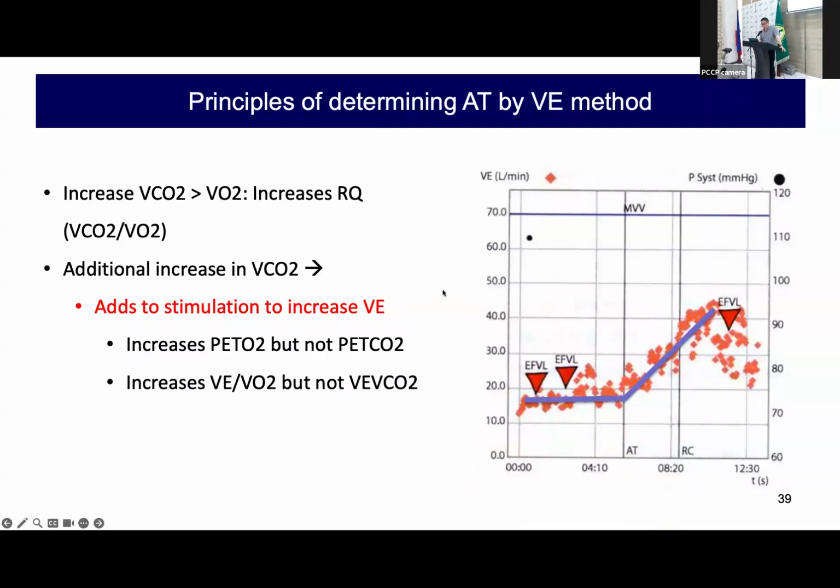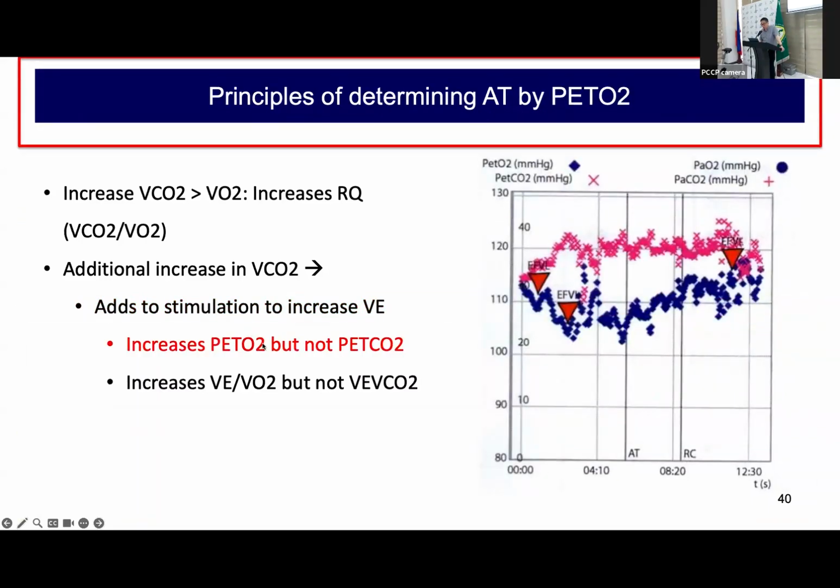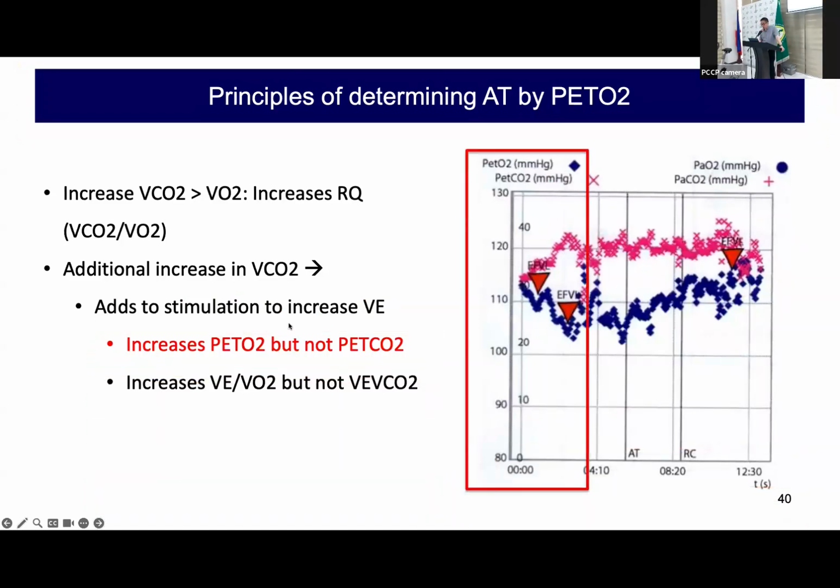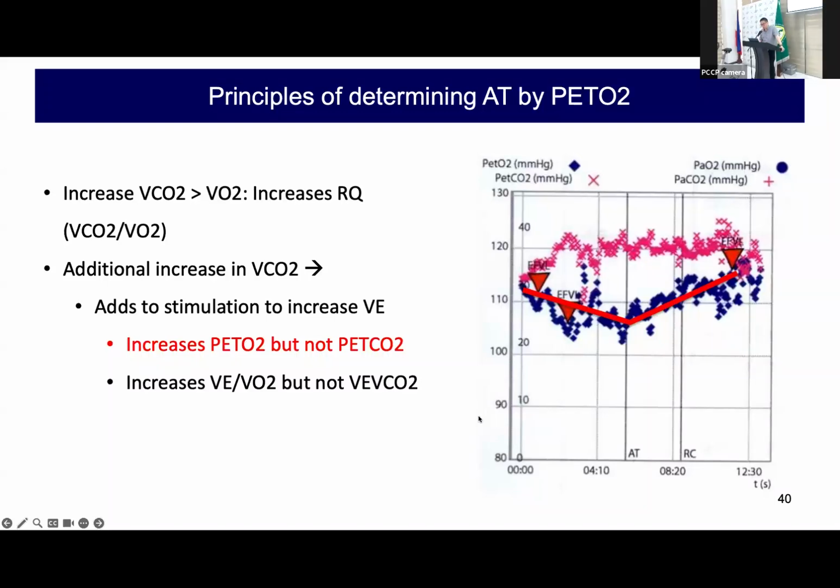Third, okay, the PETO2 method. Okay, there will be an increase in PET. X is time, Y is end-tidal O2. Can you recognize? It's in blue. Okay, notice, bumaba muna, tapos tumaas dito. So that's the onset of anaerobic threshold.